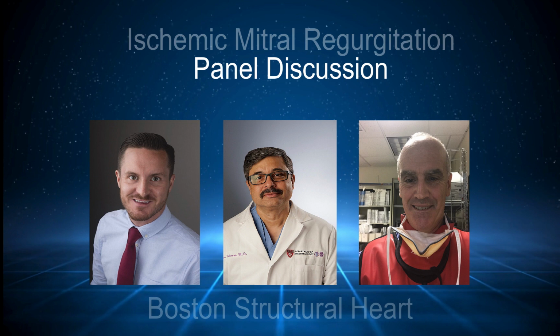I know what I need to know now to make a decision. So secondly, while you asked the question about where you measure the tenting height, mid-esophageal four-chamber, mid-esophageal commissural, mid-esophageal long axis? I know Aidan is working on it, but when we have 3D, why don't we measure the tenting volume, which represents the topography of the whole, as opposed to a section? Aidan, are you working on something like this?